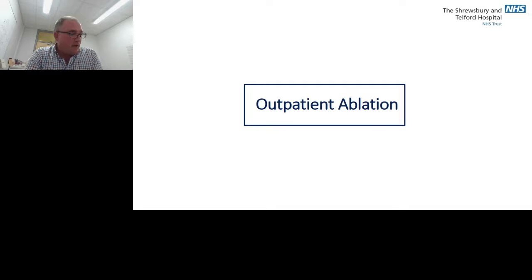In a second, you're going to see a video for an outpatient ablation. We perform master classes where we'll do live surgery with colleagues in the lecture theatre, and the images and the videos are beamed across. And you'll see a patient who's about to undergo a NovaSure ablation. You'll hear the cavity check pass initially, then we'll perform the ablation, and then at the end, we'll do a cavity check. You'll hear how myself and my team are doing the vocal local by trying to distract the patient, talking about holidays and Christmas and so on. At the end, I do ask her a pain score, and she says 2 out of 10, although on the video it's not very clear. And to the left of the patient, you won't be able to see it, but there is a HCA who's trying to distract the patient too.